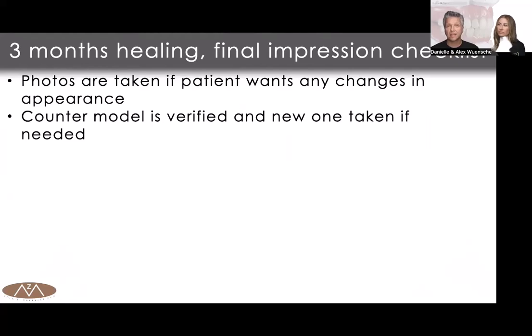A quick hint, the 2 most important photos are always full face, smile, and 1 retracted. For the retracted photo, don't zoom in, just give a full face photo, right? I think we showed this a couple modules prior to that as well. There's a little template out there. If you're interested in a photo template, just message us on YouTube or write us an email. It's info@zahnlab.com, and we're happy to send you the template.